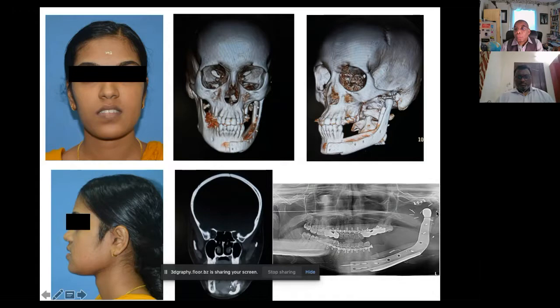So one addition that we had told in this particular prosthesis was we wanted a hole at the head of the condyle so that we could suspend it to the zygomatic arch a bit passively, so that there's no condylar sag, because once you strip off your pterygomasseteric sling, there's a high chance that your condyle may sag. So to counter that, we made a small hole in the implant, which was designed over there in Chennai, and then a PDS suture was passed through that, and it was fixed onto the zygomatic arch to prevent condylar sag.